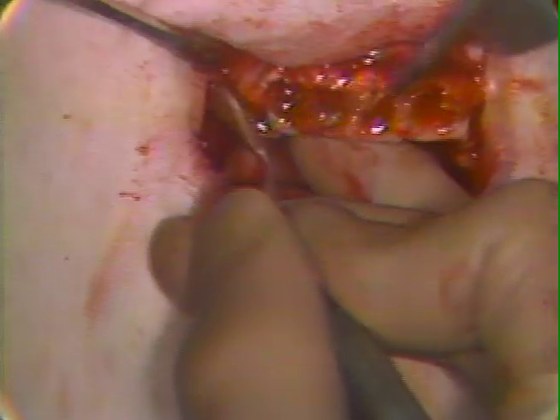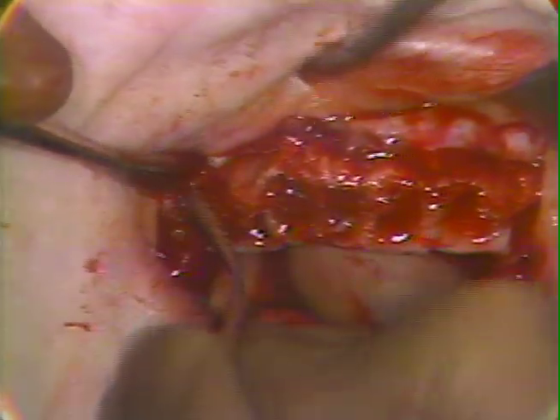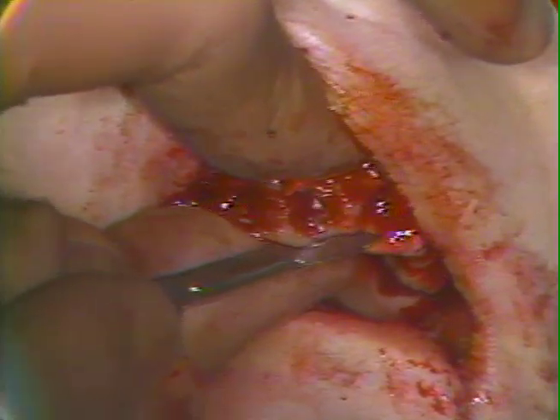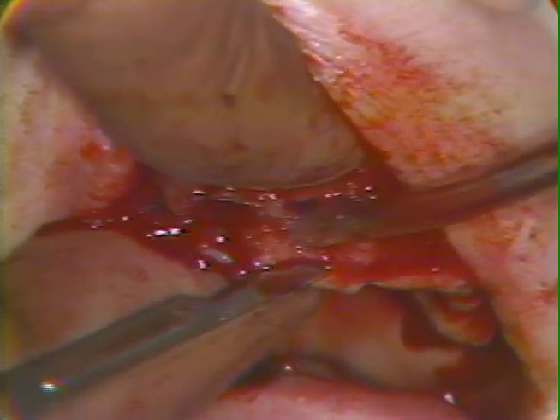Here we're returning to the alveolar process where we are using the file for final contouring. And the soft tissue trimming will be accomplished with sharp instrumentation, supporting the tissue well, making incisions that are slightly shelved, that have a slight undermining effect, keeping the field as clear as we can as we move along here.